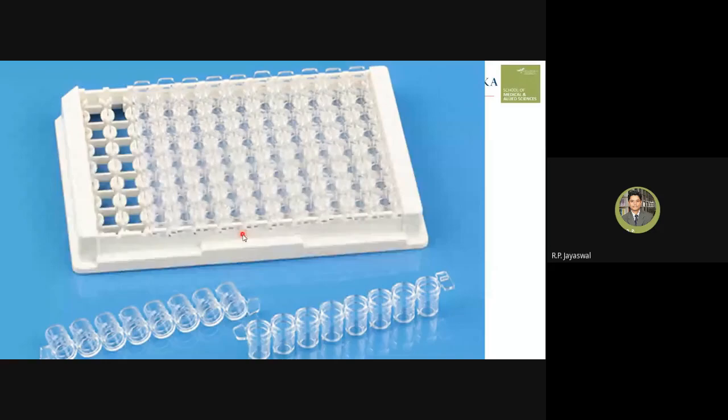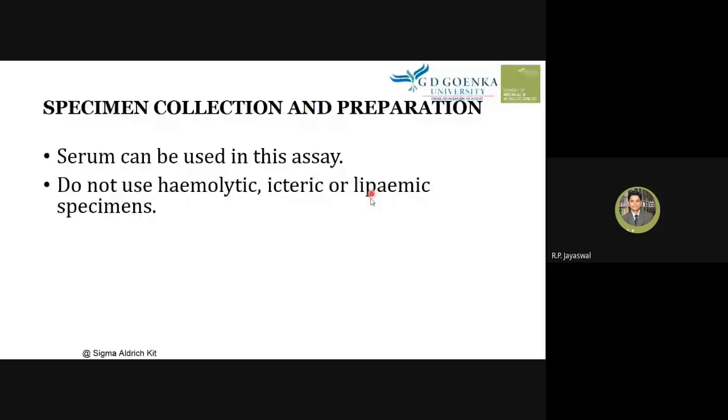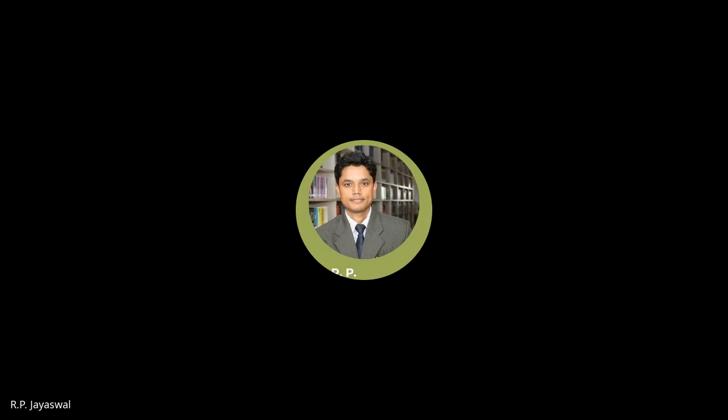Specimen collection and preparation. The specimen we require is serum. Do not use hemolytic, icteric, or lipemic specimens. Please note, samples containing sodium azide should not be used, because sodium azide inhibits HRP, horseradish peroxidase, enzyme activity.